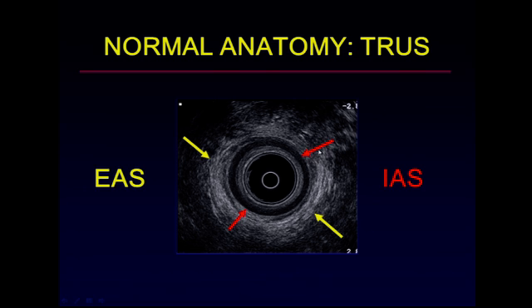Outside of that, in the transverse plane, you're going to see a 360-degree ring in the mid to lower anal canal, which represents the external sphincter. And you can sometimes see these little parallel bands within it. And as I said, it should go 360 degrees around the internal anal sphincter. Between the two sphincters, you sometimes see these hypoechoic, wispy little rings. Rarely are these confluent 360 degrees. You just see this in pieces. And these represent these longitudinal muscle fibers in the intersphincteric space.